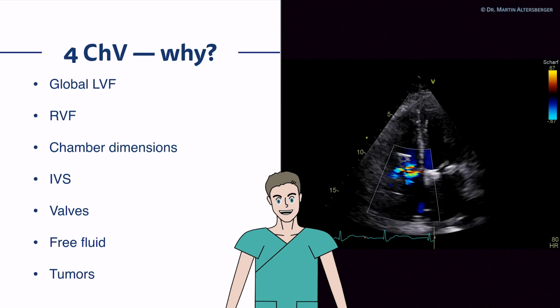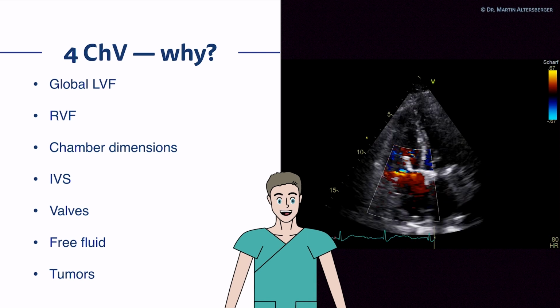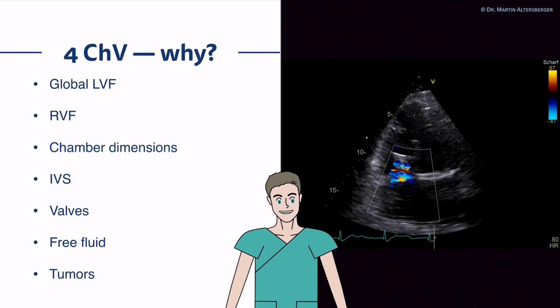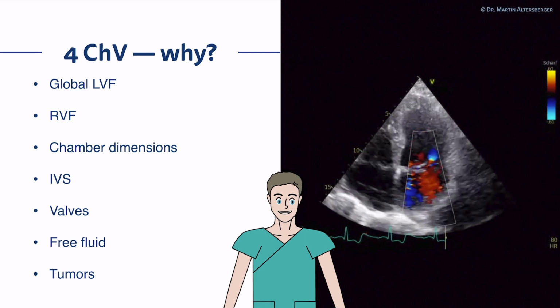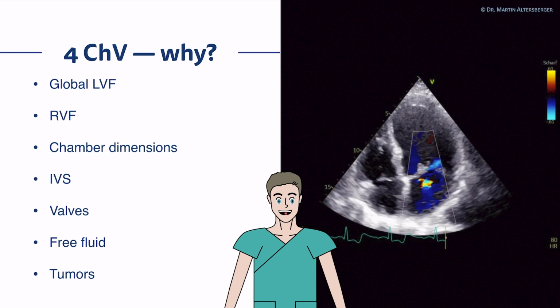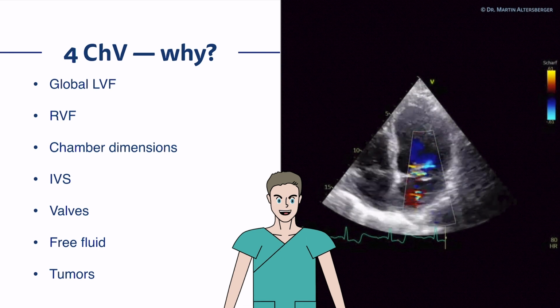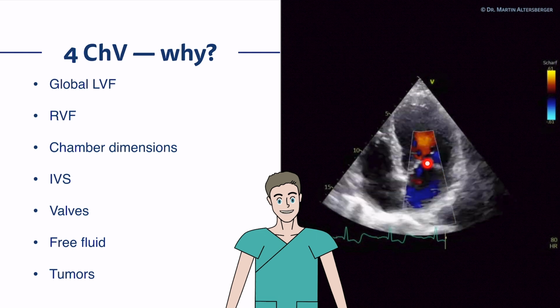And here's an example of a severe tricuspid regurgitation after a TriClip. So you see that every valve, every chamber, every structure, even clips, can be visualized in echocardiography. Here's another example of a four-chamber view, and there's a problem with the valve. You see the left ventricle seems borderline in size, almost a little bit dilated already, and you do see that the valve has a problem.